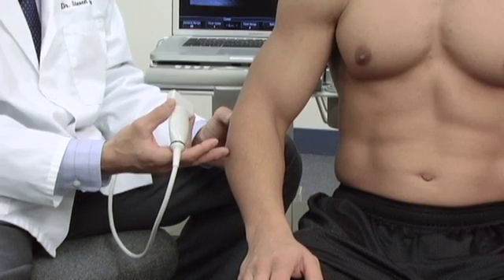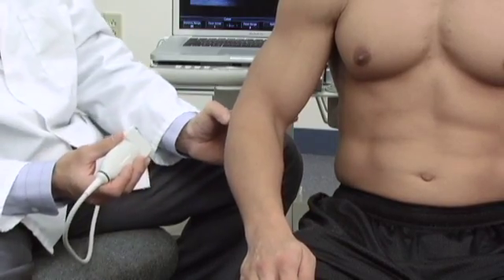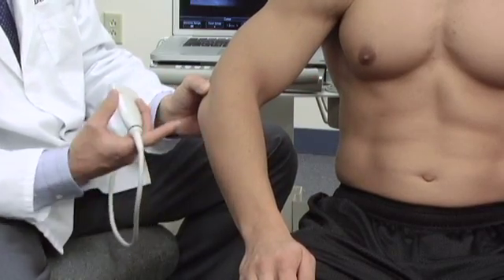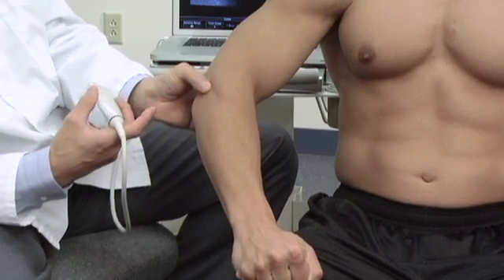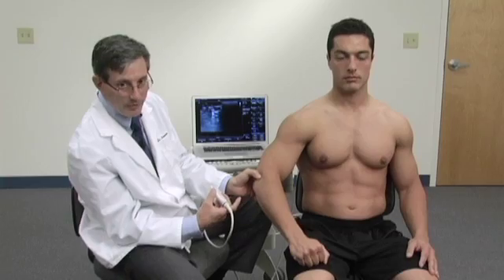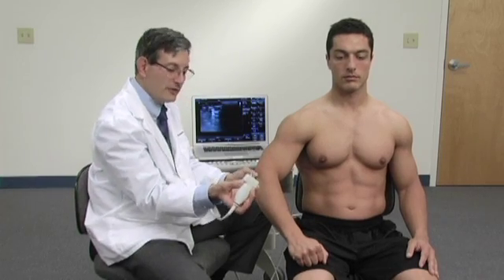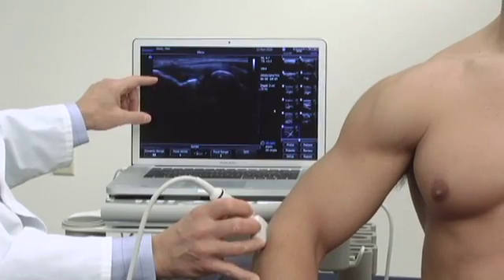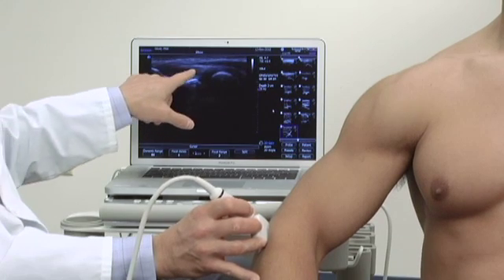We're going to look at the common extensor tendon. To do that, we'll palpate over the lateral epicondyle. We can clearly see — if you would make a fist for me — how the muscles attach into this and form the common extensor tendon. Placing our thumb right where patients usually complain of peak pain, I'm going to place the probe so that the notch is to the proximal aspect of his arm, right over the lateral epicondyle. This is the lateral epicondyle and this is the common extensor tendon.